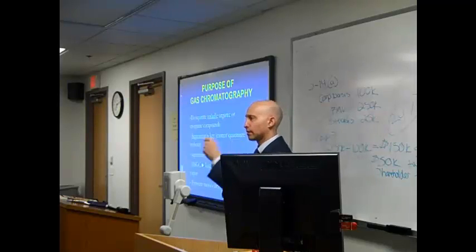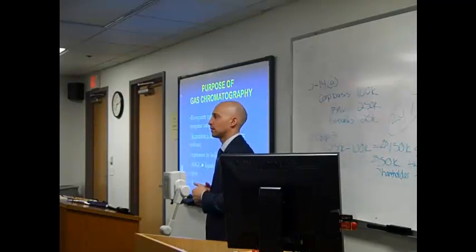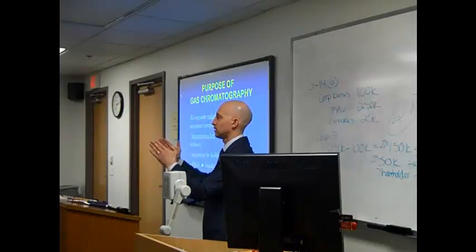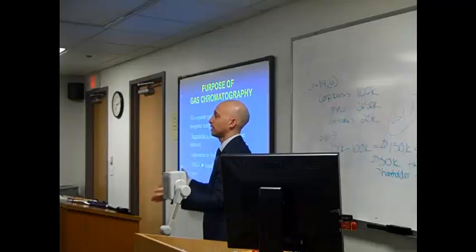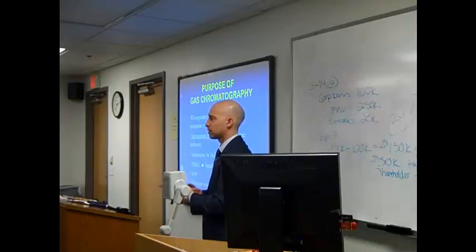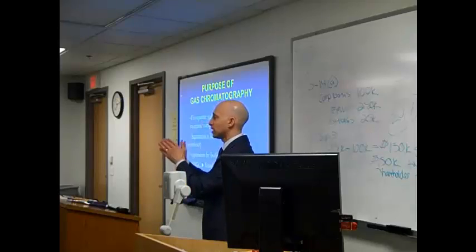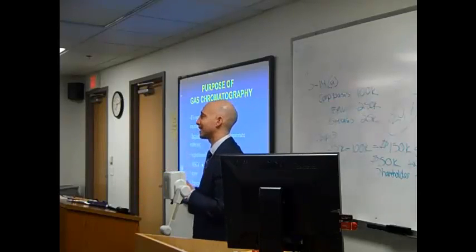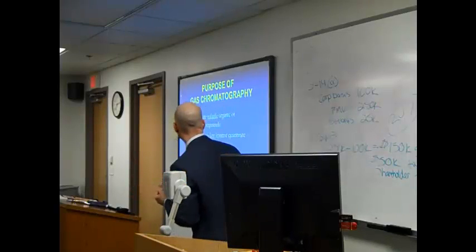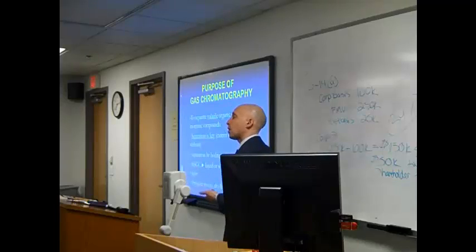Now, there's one thing you got to do with gas chromatography, and that's the total basis for it, which is separation. Separation of compounds. Separations of molecules. So, blood is tested. It's going to have a number of different compounds in it. What you have to do is be able to separate and identify each one of those. If through the testing process they cannot separate, then it's not good. Testing's no good. And you can't quantitate.